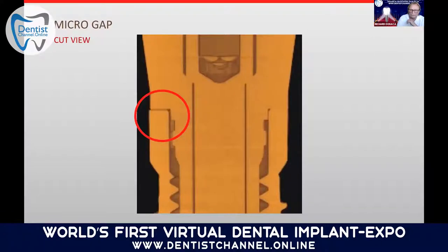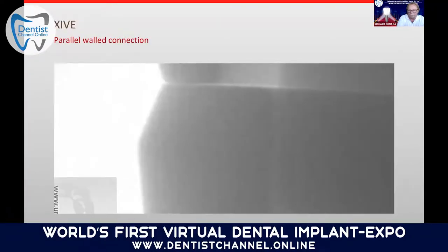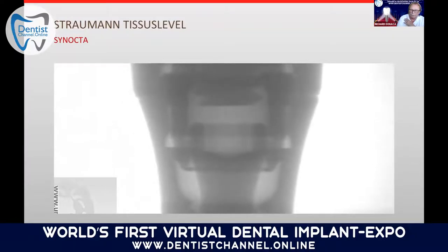You can see here on the cut view the micro gap, and especially under load, you have implants with a gap or a micro pump effect, where you have bacteria going into the implant, pumping bacteria in and out, which will of course cause bone and soft tissue loss.